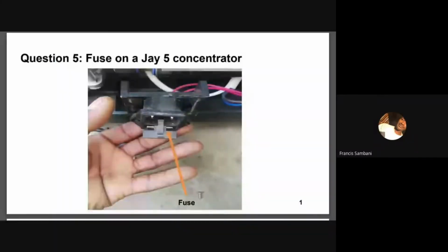Thank you, Maui. Firstly, it should be noted that this is a common problem, and it was right for the person who sent in this problem to check the top plug fuse. After checking the fuse and finding it okay, the next thing the person would be advised to do is to check the continuity of the power cord itself. That is, you should check the continuity of the live, neutral, and the earth wire, if this model has the earth wire.